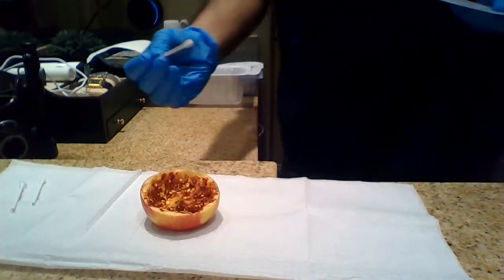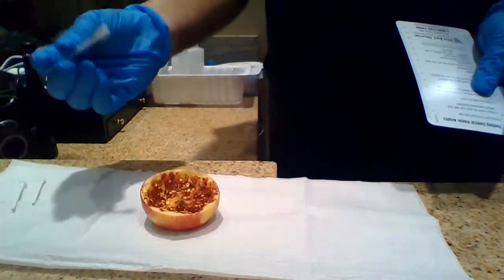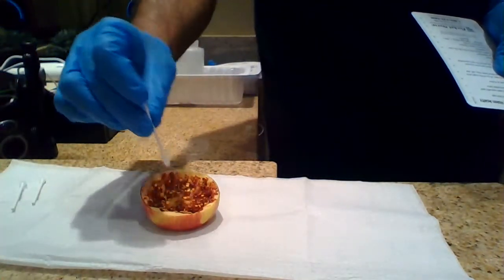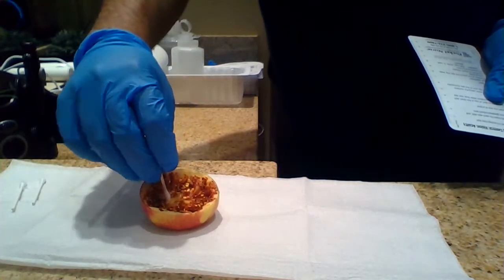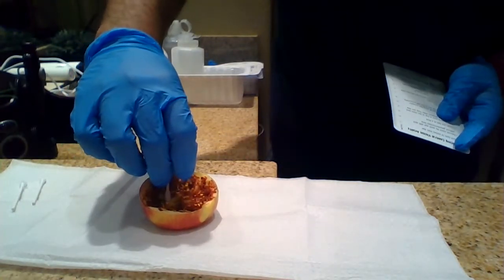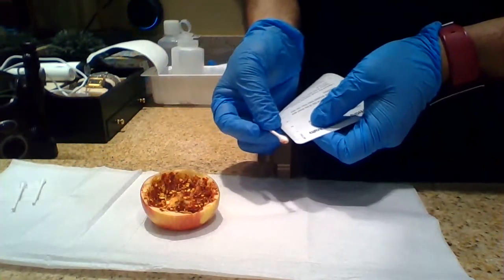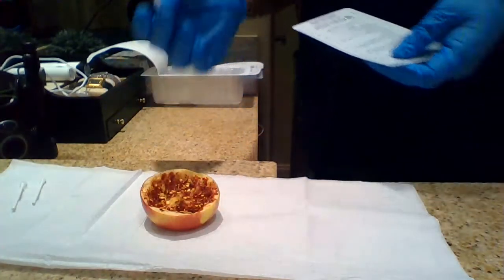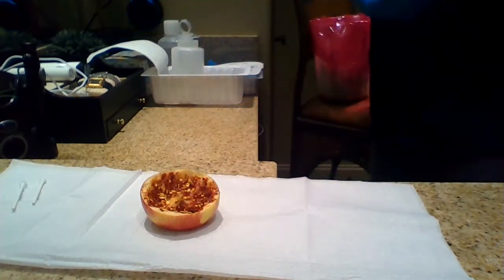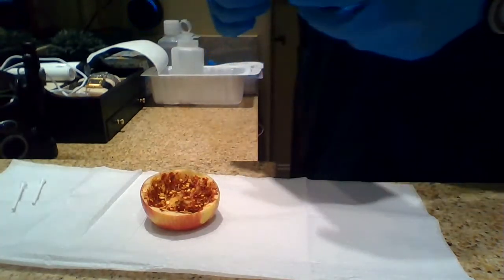So when we measure our depth, we use a Q-tip. And the way we do that, we reach the most deepest point. We stick the Q-tip, obviously not stabbing them. And then we keep our finger on there where it's at. And then we just measure where it's at. So that's about 2.5 centimeters. So that we dispose of again in the biohazard bag.